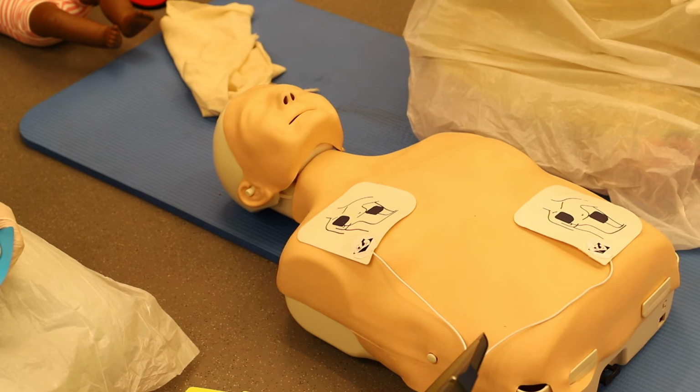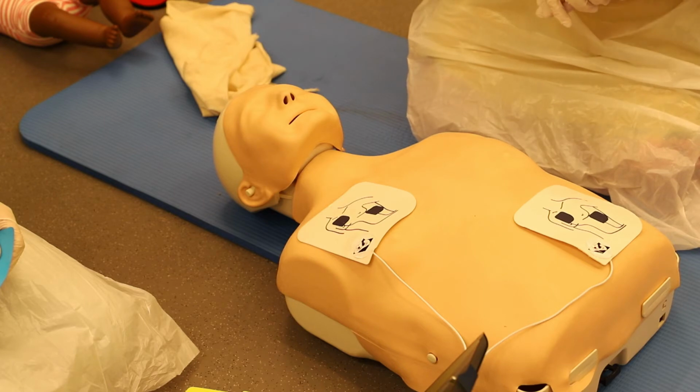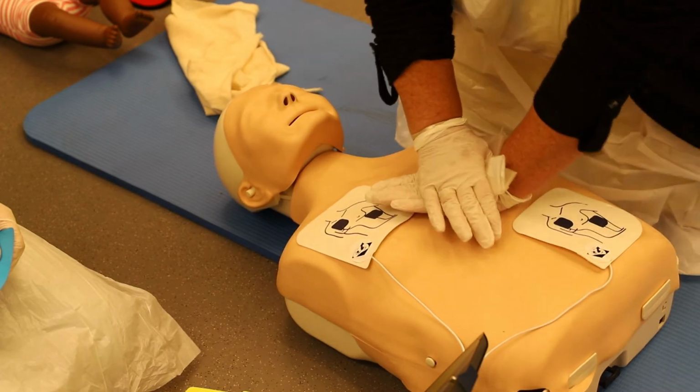Okay, so the shock's been delivered. Start CPR. Now I can continue with CPR. Give 30 compressions. Then give 2 breaths.